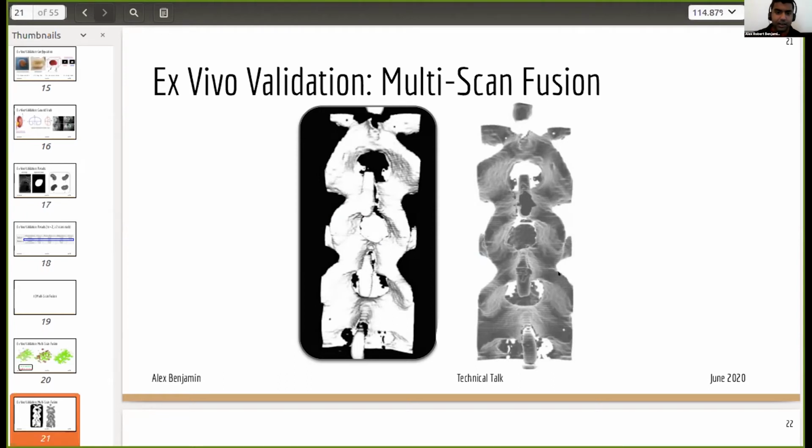People may be thinking that that's a lot of scans to perform, but it really does not take very long to scan 4 vertebrae of your lower back. The whole 14 or 15 passes probably take about 5 minutes. So in 5 minutes, you can get a pretty high level of detail and accuracy from ultrasound scanners, which was previously not possible because you would rely on 2D images.